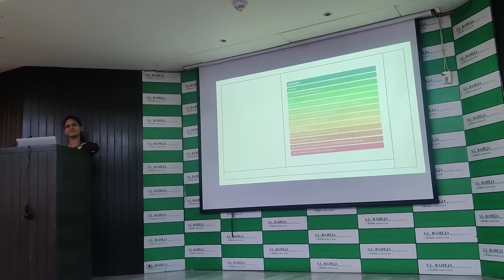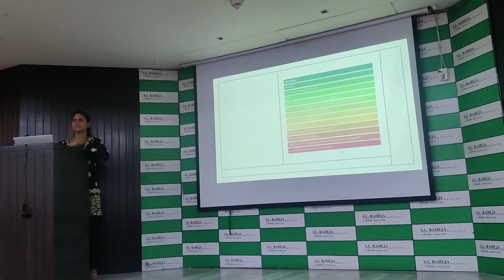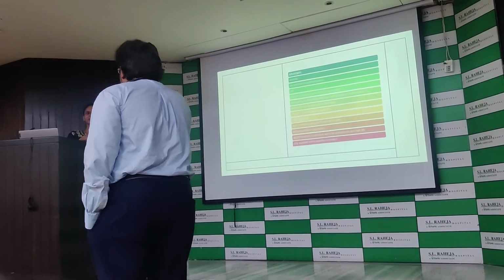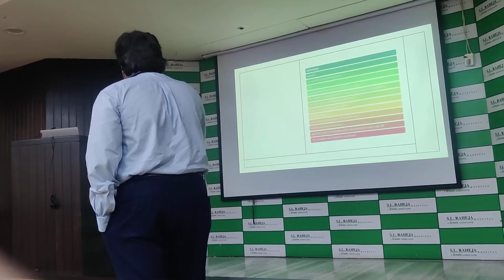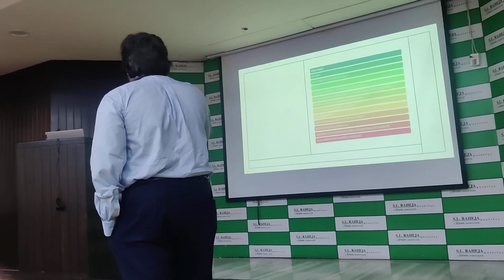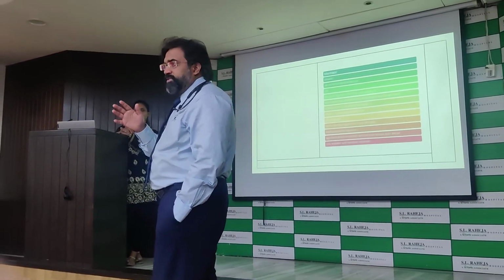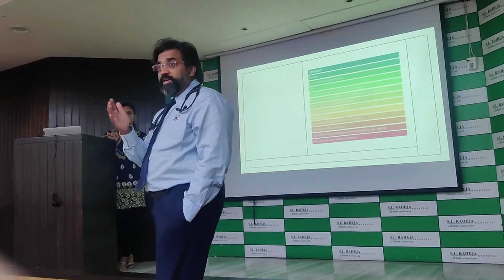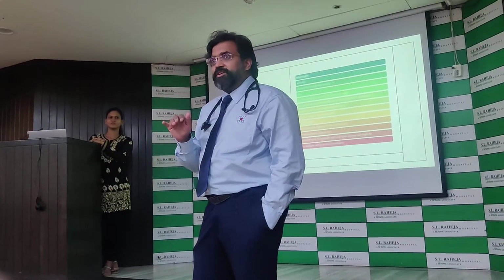So that's what happened in one of our patients. What happened to that patient? He started breathing at a higher RR. Yes, the patient is ventilating at a higher RR. But you must understand that a higher RR is not as dangerous as a higher tidal volume. The pathology is different. The patient is breathing fast, and the ventilator is breathing fast with the patient, but it's not giving high tidal volumes. So it is still comfortable. It is still okay. You treat the cause.